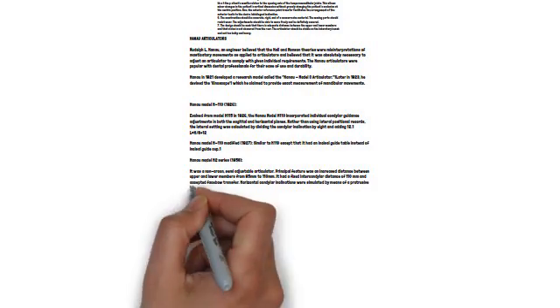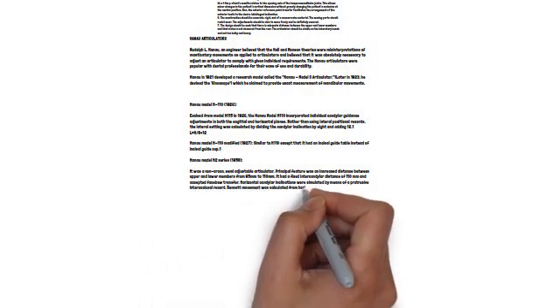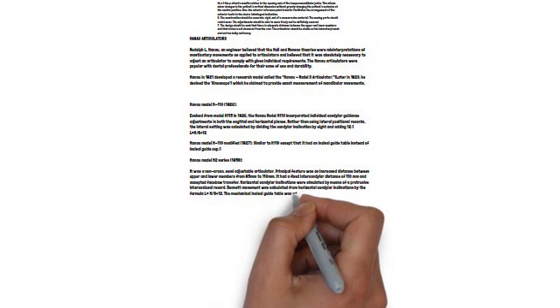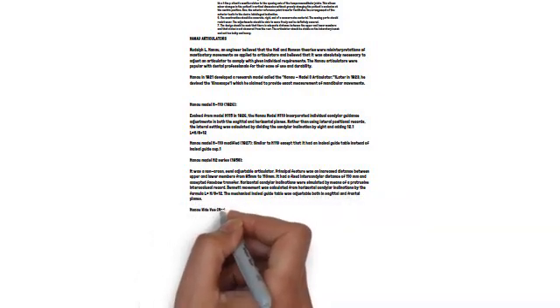Horizontal condylar inclinations were simulated by means of a protrusive interocclusal record. Bennett movement was calculated from horizontal condylar inclinations by the formula L equals H/8 plus 12. The mechanical incisal guide table was adjustable both in sagittal and frontal planes.